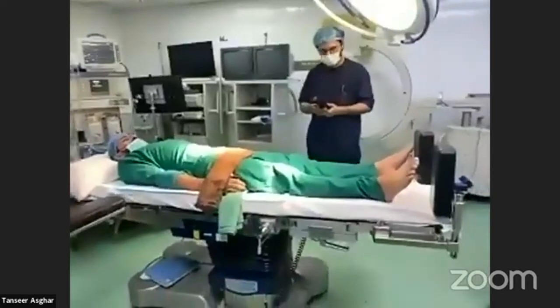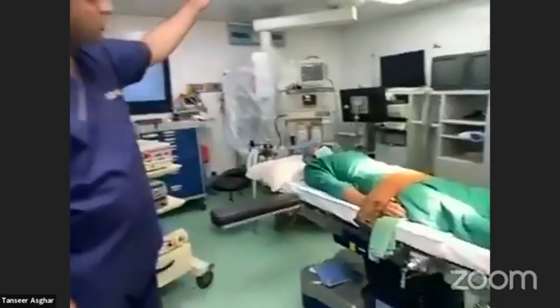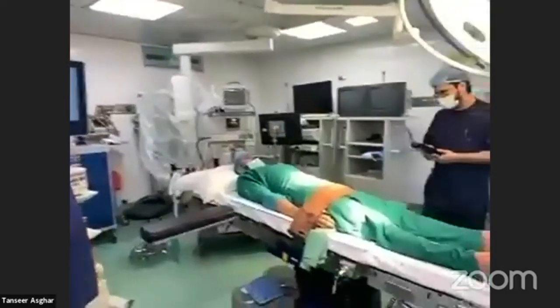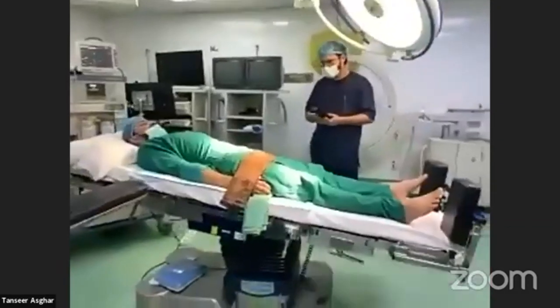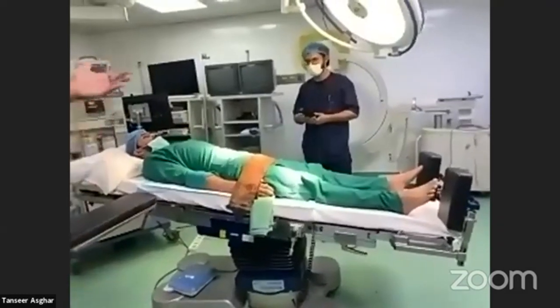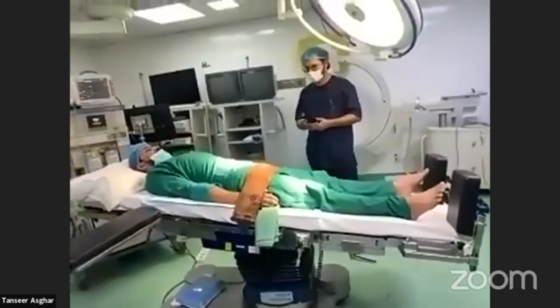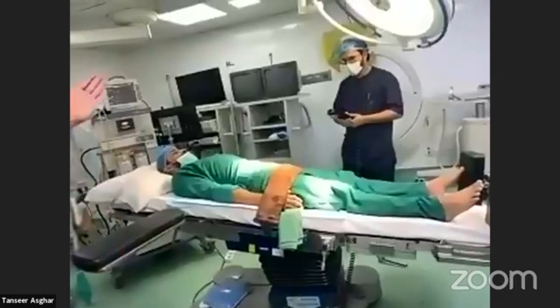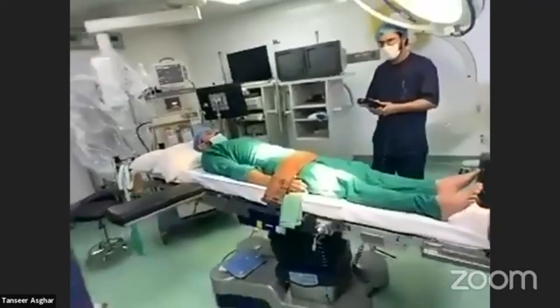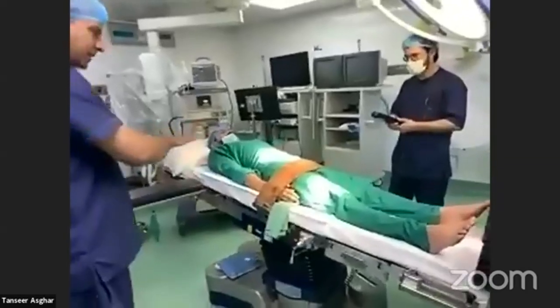The other position is the reverse Trendelenburg — head up. This position is usually used in laparoscopic cholecystectomy and laparoscopic bariatric procedures. You can also add a right-up tilt, which is commonly used in laparoscopic cholecystectomy. Then you can flatten the bed again.